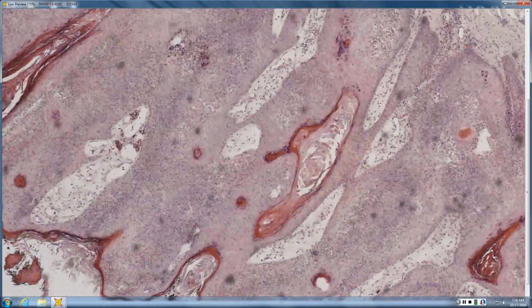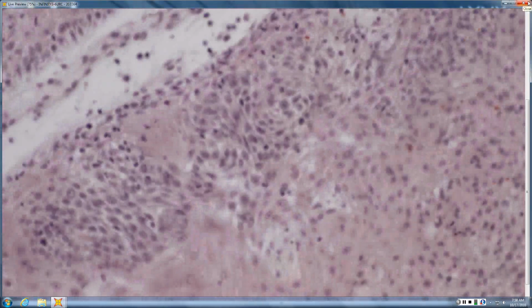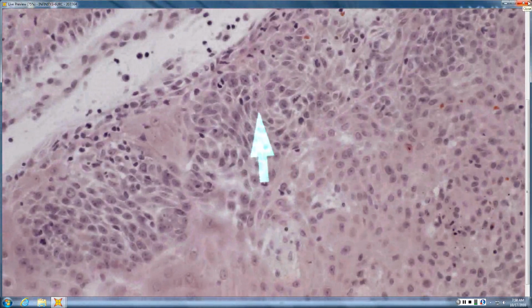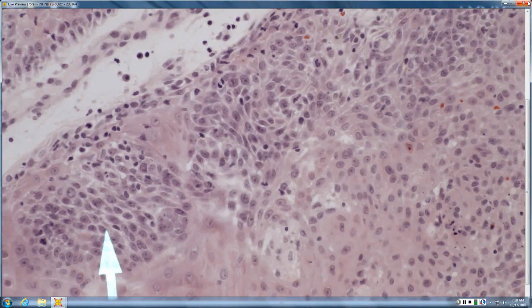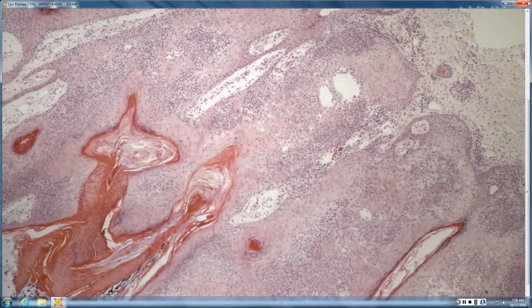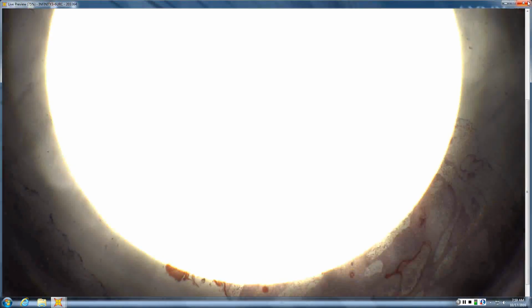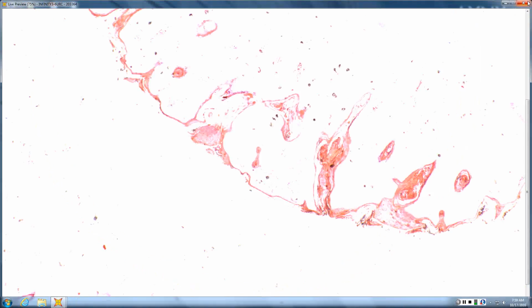So, irritated seborrheic keratosis. You see the horn cysts. You see clonality. There is spindling and squamous eddies within those clonal nests. There's pigment. There's inflammation. So you could have legitimately said an inflamed clonal irritated seborrheic keratosis, ISK is fine. As the epithelium can look kind of wild, these are frequently overcalled. But just recognizing the architecture at scan is key.